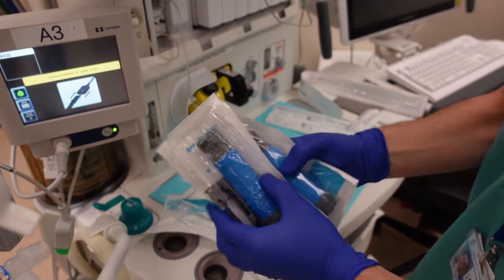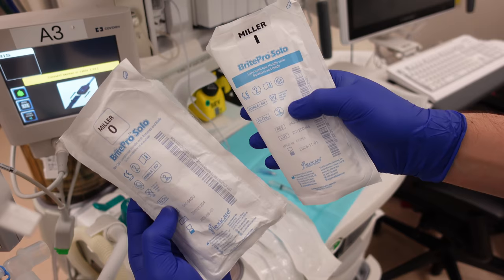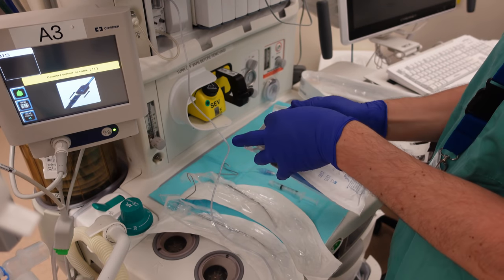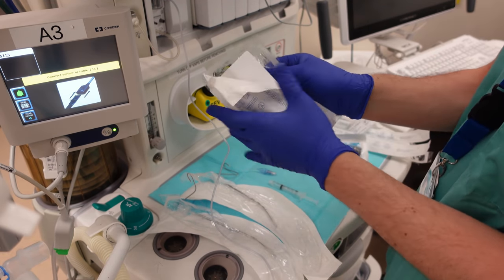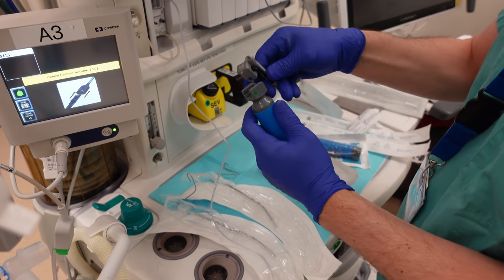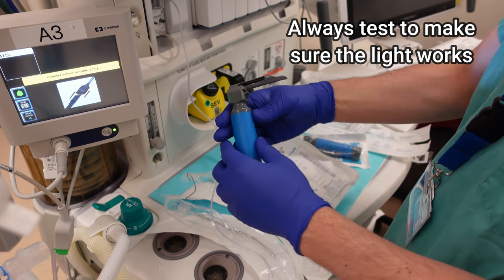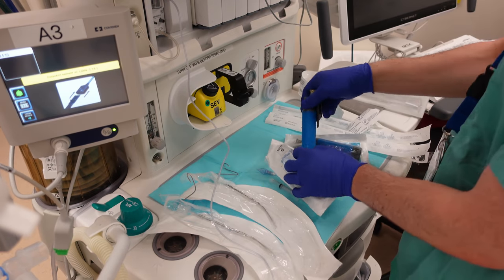Next I'm going to have several different intubating blades — these are both straight blades, also called Miller blades, which are used most commonly in pediatric cases, particularly with very young children. I want to make sure I've got several sizes available just in case the first blade isn't the right size and I need something else — I want it right on hand next to me ready to go.